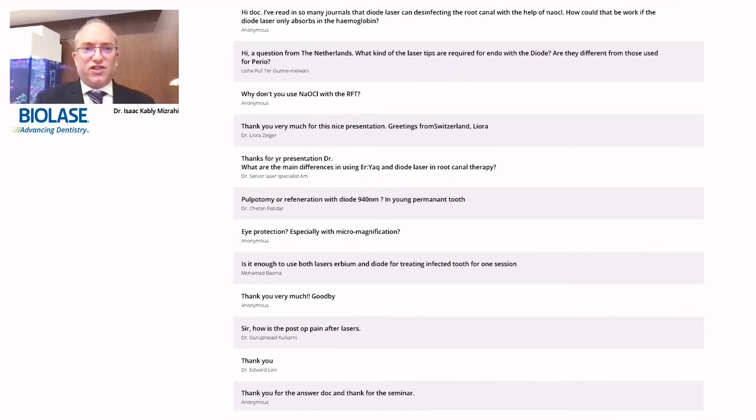So it will work. I don't use it because, instead of sodium hypochlorite, I use the protocol combining the 2780 nanometer laser and the 940 nanometer laser.